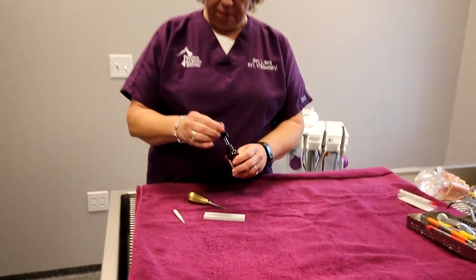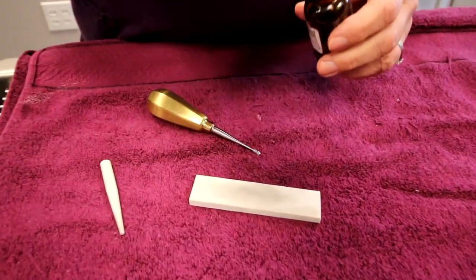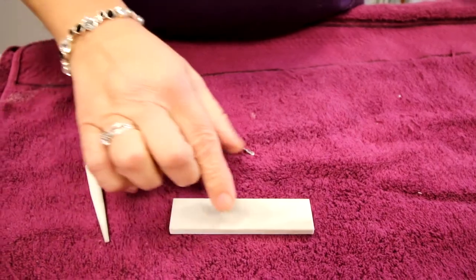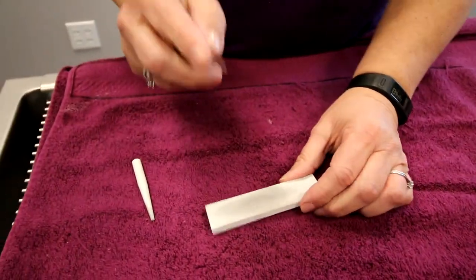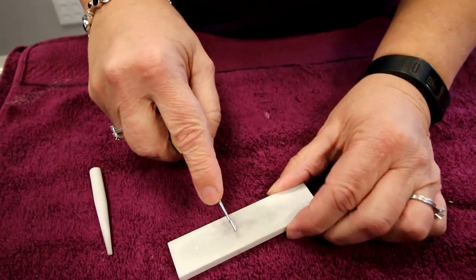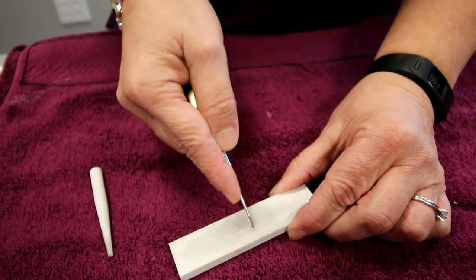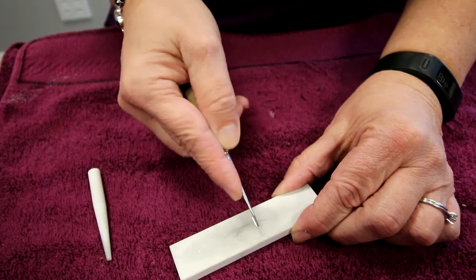I'm going to go ahead and put a drop of the sharpening oil on my stone and spread it out a little bit. Then I'm going to take my elevator, hold it as if we were using it in the oral cavity, and just go ahead and make a smile using it at about a 45 degree angle to keep that bevel working.